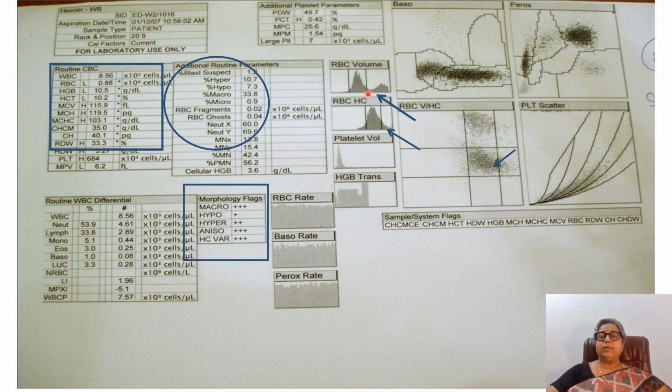When you look at the scatter, just like you see two populations, you're seeing two populations here also. That is very significant. There's macrocytosis, which could mean reticulocytes or red cells that are larger, or red cell clumps. All can cause macrocytosis. And there is hyperchromasia, which is the presence of spherocytes. There's anisocytosis and there's a variation in the hemoglobin. Now again, because of the presence of these two, which correlate so beautifully, and the huge macrocytic population, we are thinking that there could possibly be two distinct cell populations.